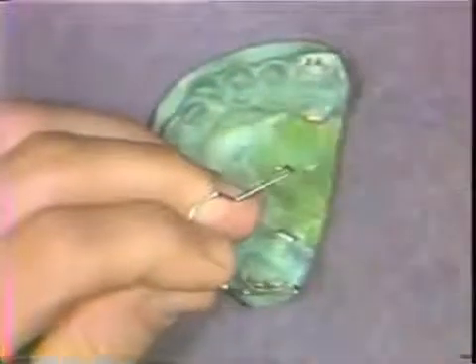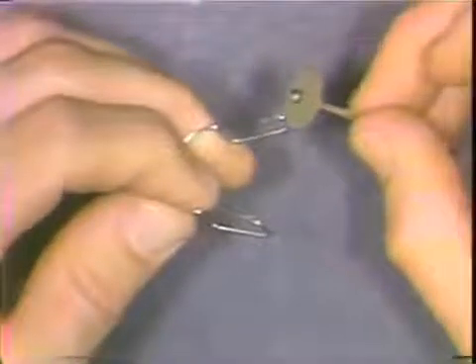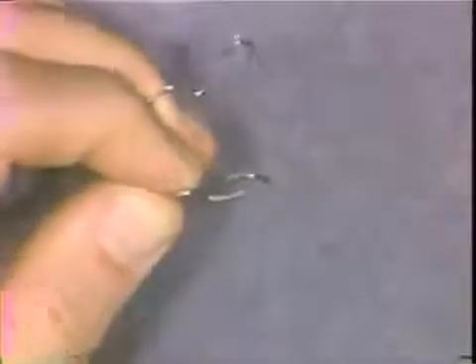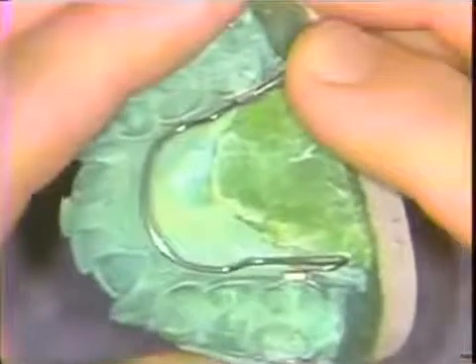The ends of the vertical post are finished down with the use of the abrasive wheel so as to make it perfectly smooth to a patient's tongue and soft tissues. Then the lingual arch is inserted, and you can see that it's inserted from the distal so as to make access much easier and to avoid dangers in chipping and breaking the anterior teeth with plier manipulation.